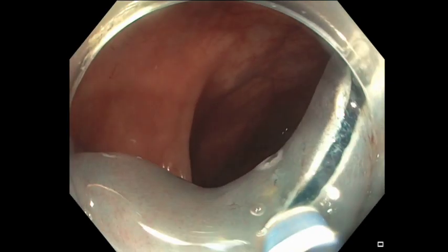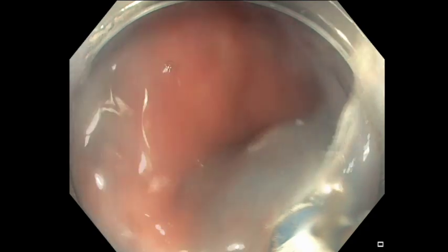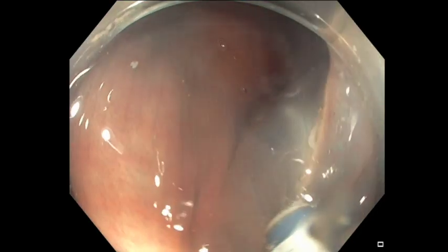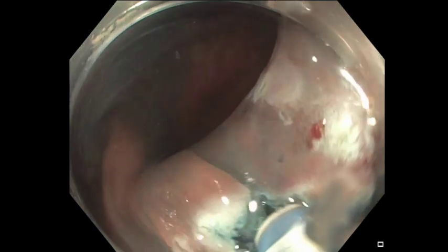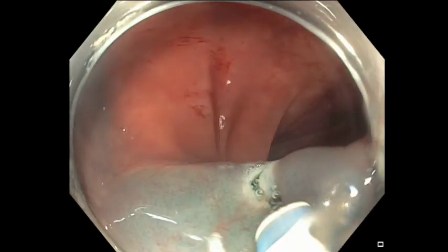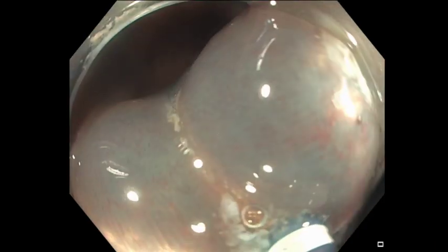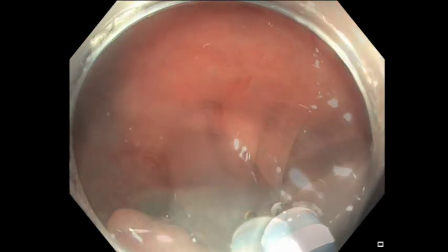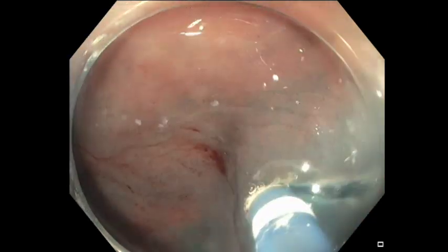You can notice here early on that the liquid is actually on the upper side of the screen. And right now we're doing the circumferential incision around the lesion. That circumferential incision will allow us to ensure we're getting a clean margin all around. You notice here that I'm also using the injection port of the knife to inject while I'm dissecting, because in the initial cut, you might go a little bit deep.